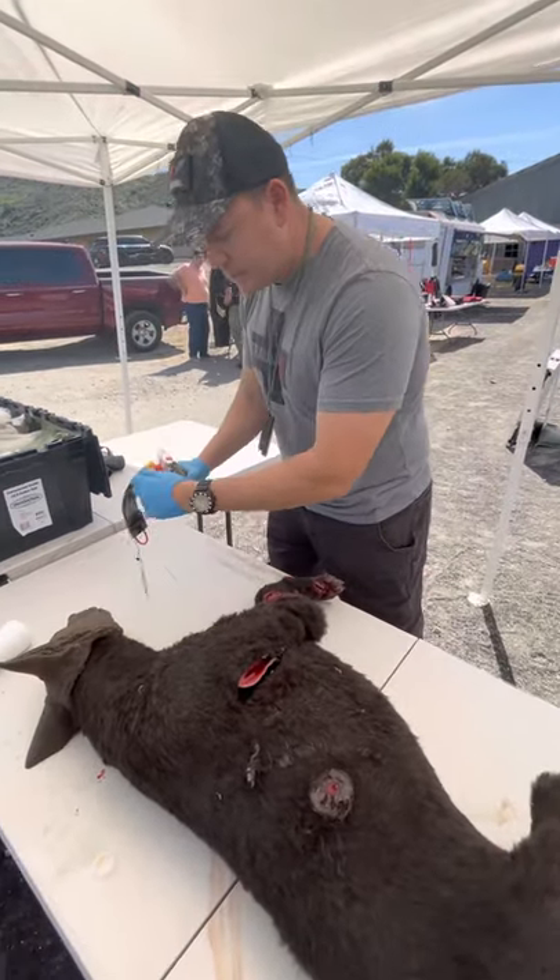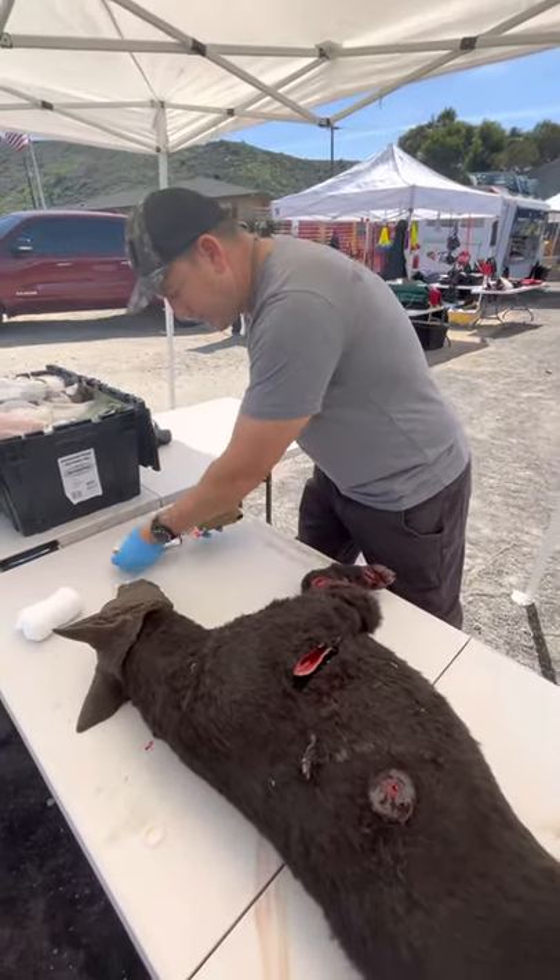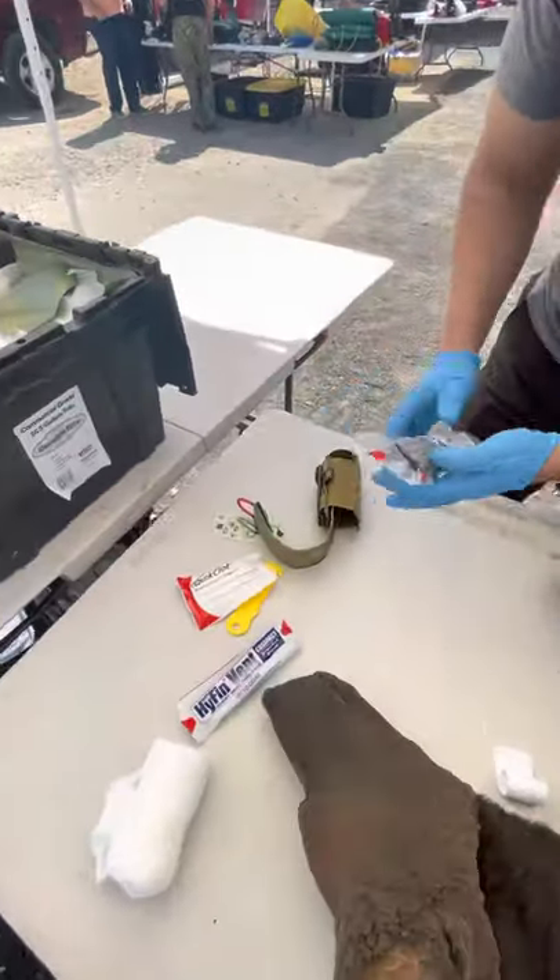This kit is going to have a chest seal, a cutter, quick clot, and an elastic bandage.